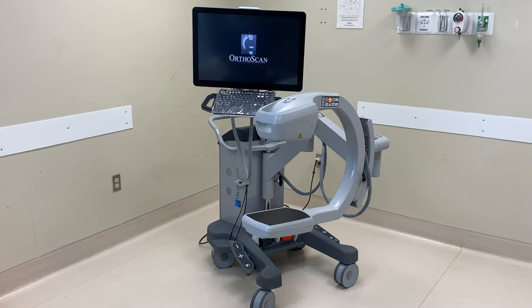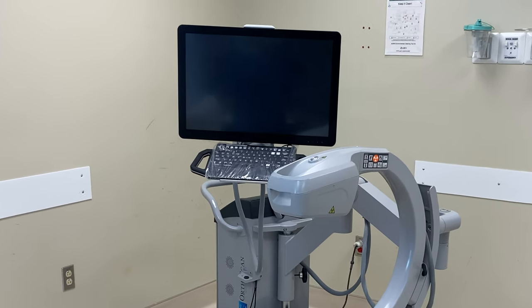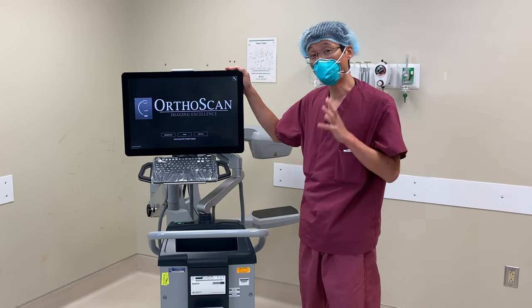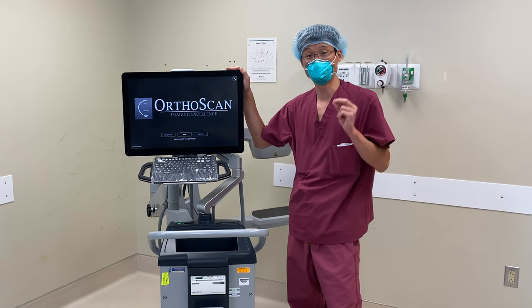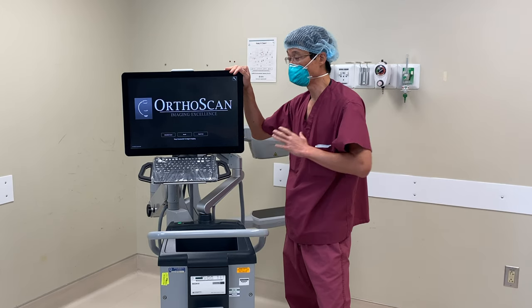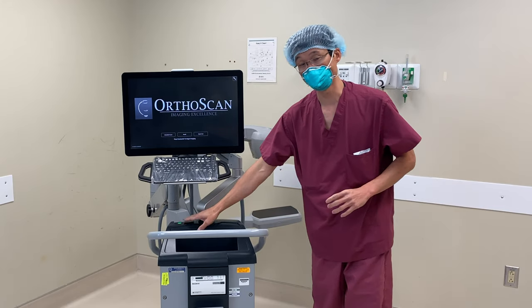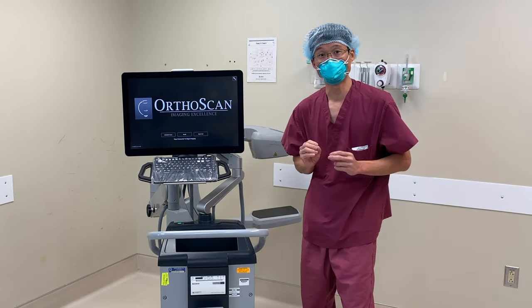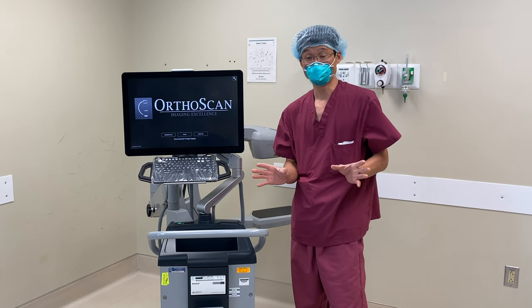In our operating room we use the OrthoScan mini c-arm and it's the workhorse for everything from hand surgery to elbow surgery. But it has one major limitation — it cannot capture video of your fluoroscopy images. It takes great photos of your still images and you can either save to a USB or print to a printer, but you cannot save your live feed video.